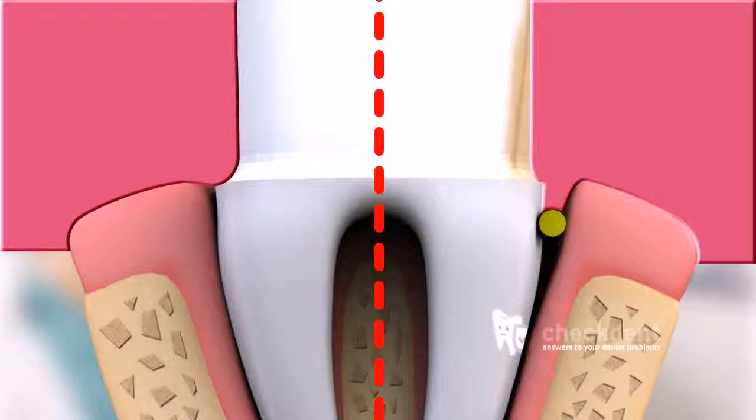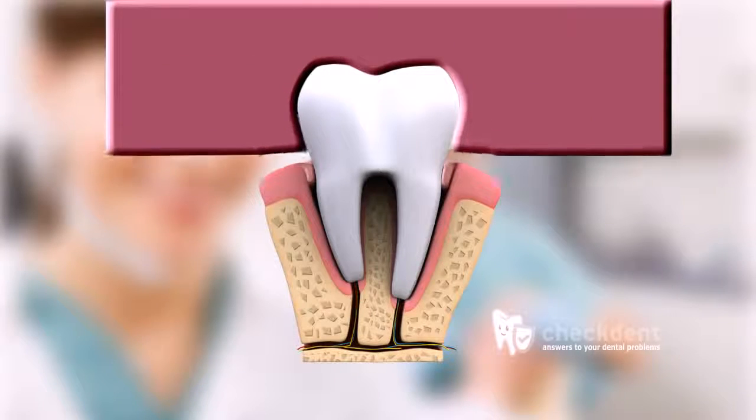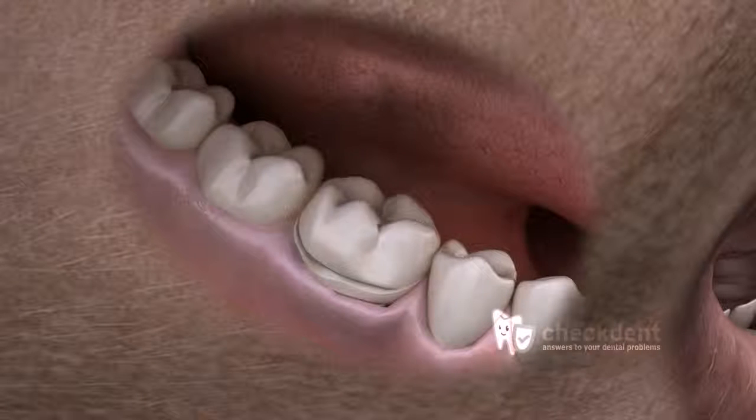On the left, the consequences of not using ligatures can be seen. The plaster mold does not correspond to the prepared tooth, as the impression material has not recorded the preparation margins. This could be because of the presence of interfering gingiva and/or blood or saliva. The technician will unknowingly prepare an ill-fitting crown.